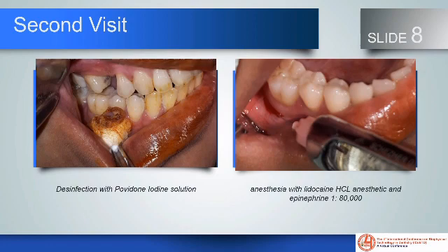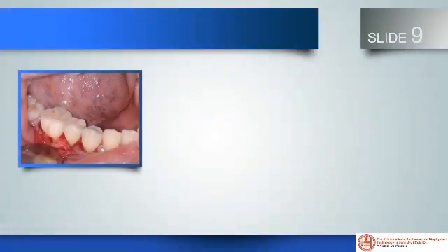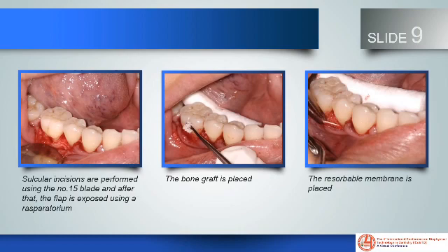In the second visit, one week after splinting, the patient was recalled for surgical procedure. Extra-oral and intraoral disinfection were performed with 2% povidone-iodine solution. Then infiltrate local anesthesia was performed. Crevicular incisions were performed using the number 15 blade, and after that the flap was exposed using a periosteal elevator. Curettage of granulation tissue and debris removal using Gracey curettes and then root planing. Irrigation with saline solution. The bone graft was placed on the bone defect and membrane was placed on top of it.